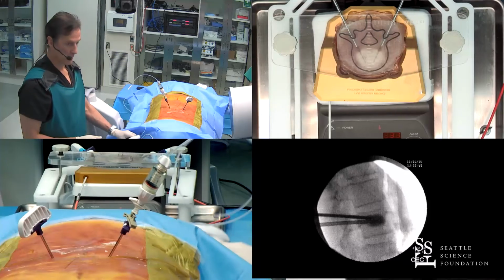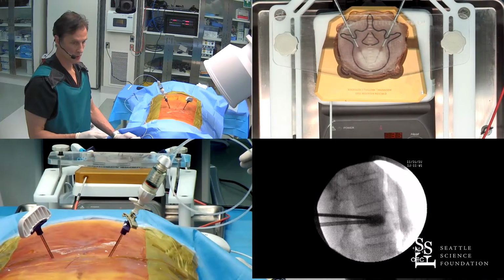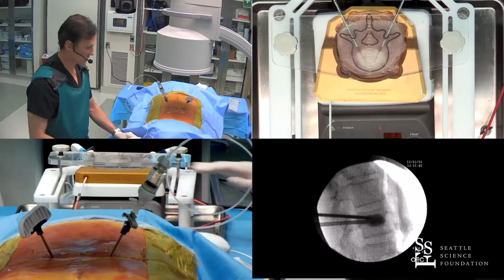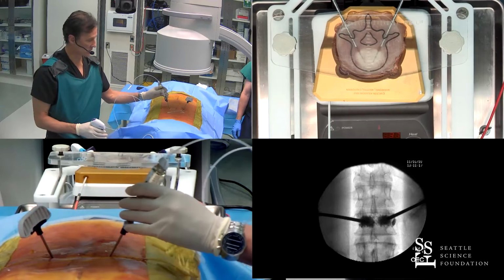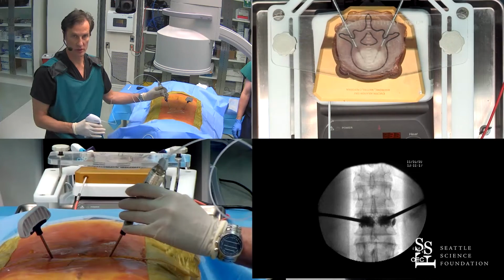And for our audience, Doug, when it extravasates into the disc, are you worried? Say that one more time, Glenn. When you have extravasation into the disc? Extravasation into the disc, the only significance that has is that it accelerates disc degeneration, causes premature degenerative disc disease.